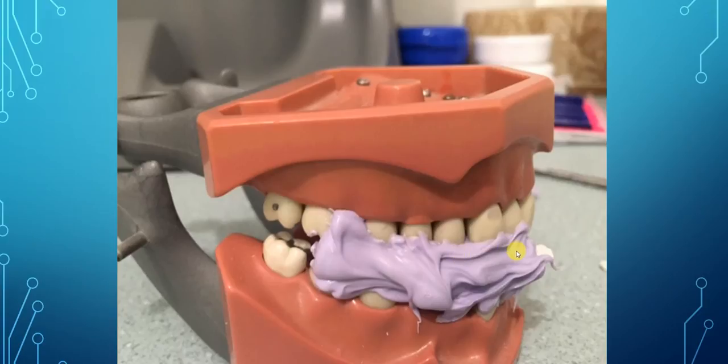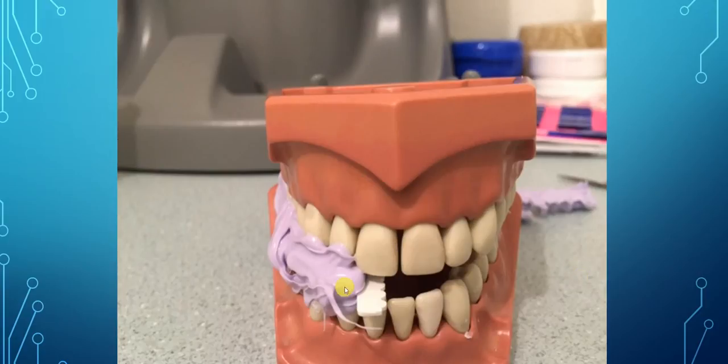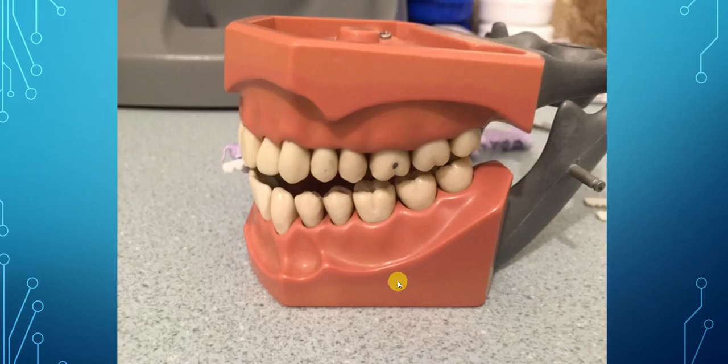Put one side into the patient's mouth, and it slides right in where they bite right back into that same position. Don't do it on both sides — just put it on one side at a time. So here you can see one side, and then the other side is not done. Then you take your scanner and scan that side of the mouth all the way through to where you don't have the jig, capture, stop, and then go and do the other side as well.